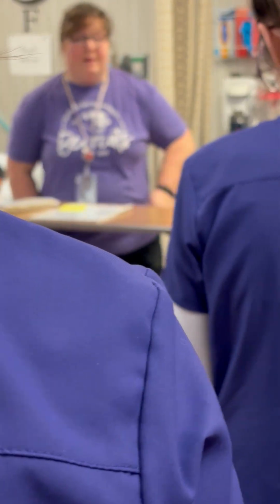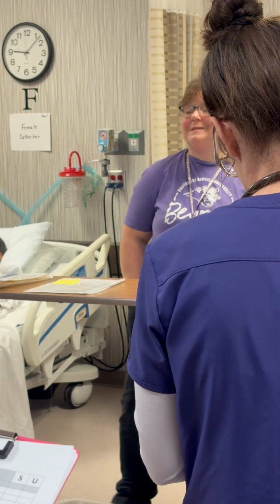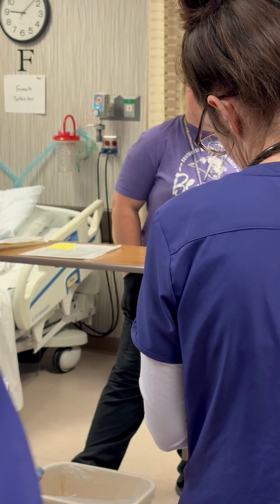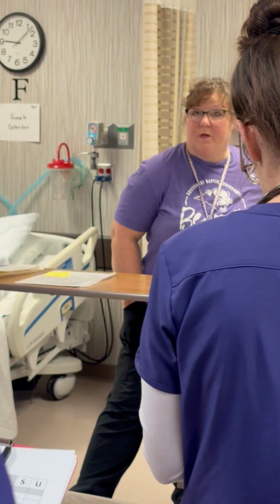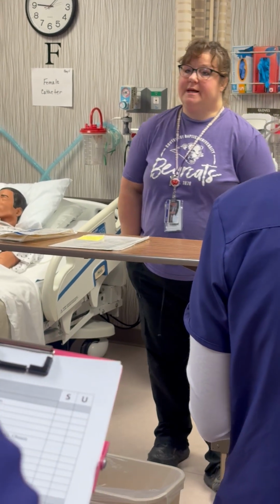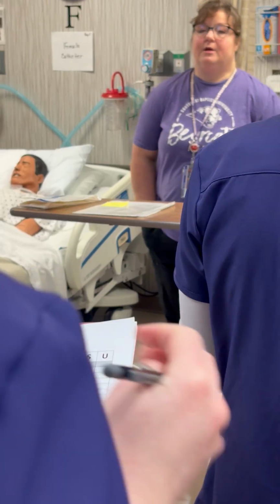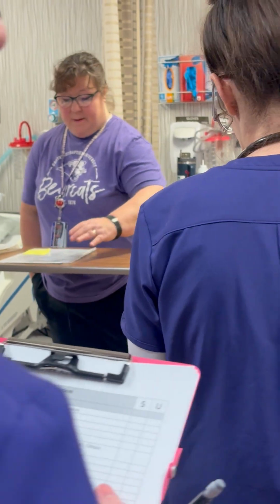So this one, you need to make sure that you're asking allergies, and you need to ask that BLISS. So it's an acronym for betadine, latex, iodine, shellfish, and silver, okay? You must ask that. Please don't say, are you allergic to BLISS, okay? You have to say betadine, iodine, latex, silver, and shellfish, okay? So those are the things up here.